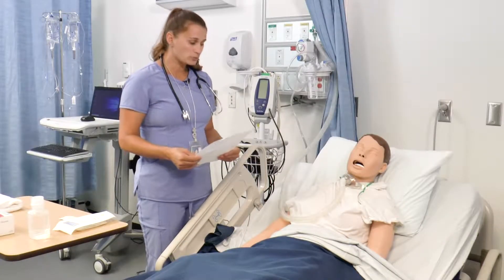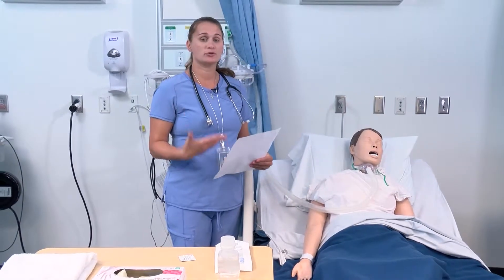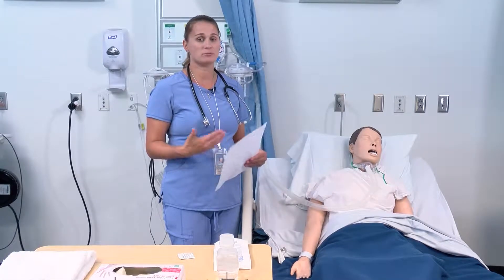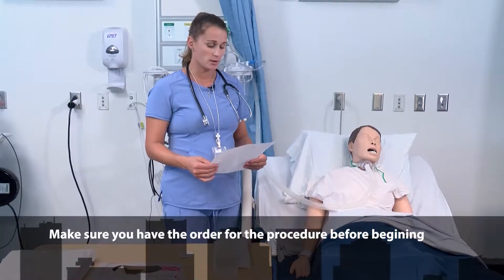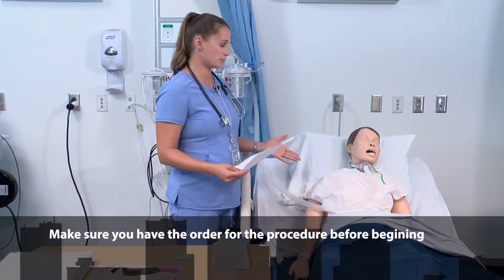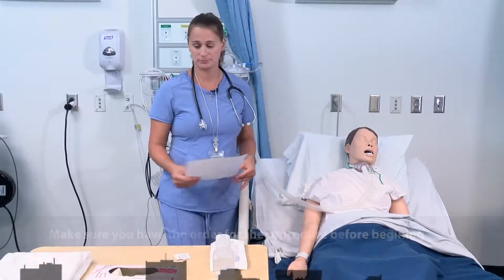My order would state that I need to do tracheostomy suction and what the indicators are — maybe it's a PRN order — but I need to make sure that I have that order before I ever perform any procedure on the patient.